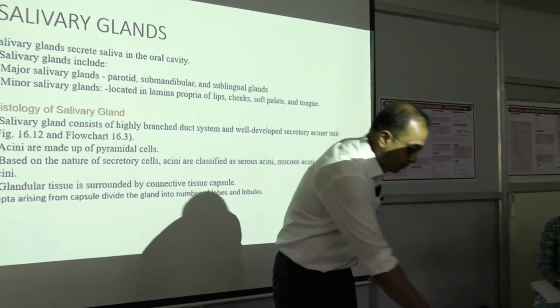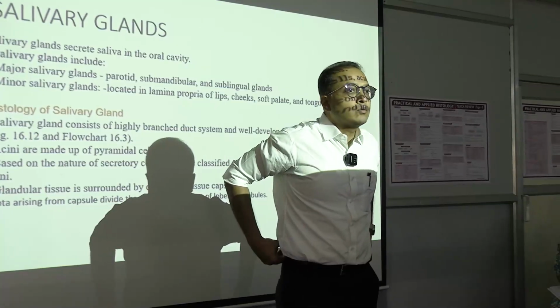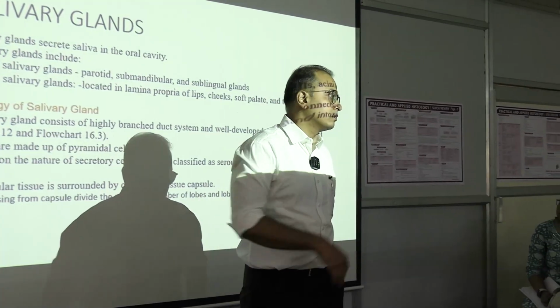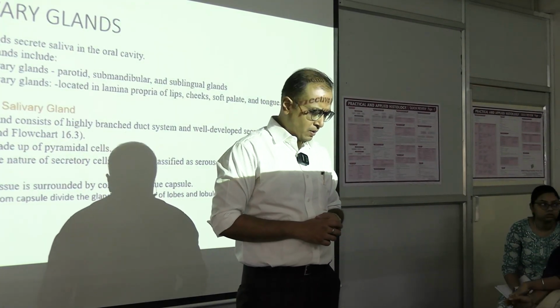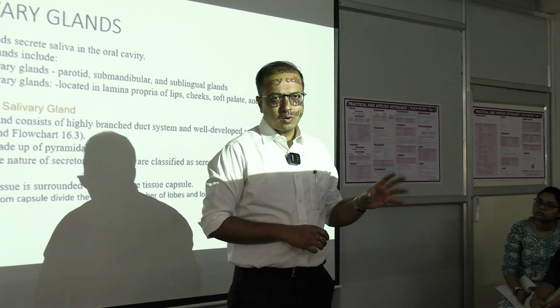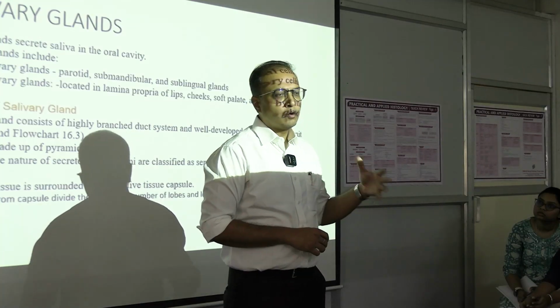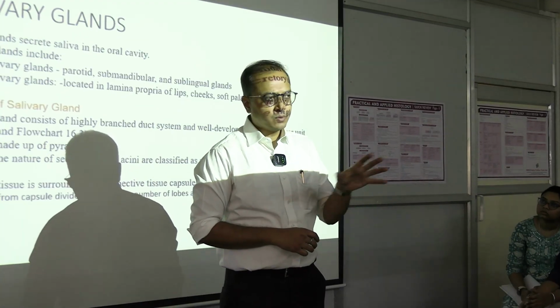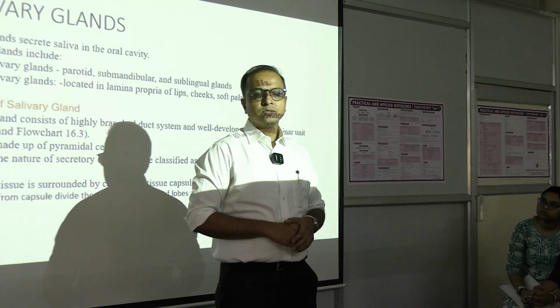Starting with the proper histoanatomy. We are going into the structure identification now, and we will be proceeding to the rest of the structures that are going to come. The general part of this microanatomy is over. So, we are going to project individual organs, and then identify how to identify them and how to separate between these similar structures that we are seeing.